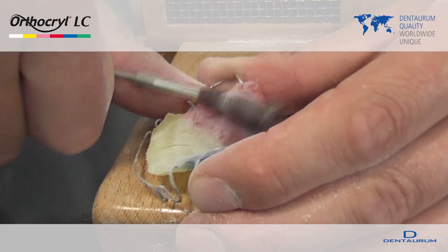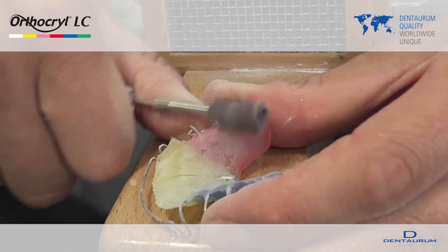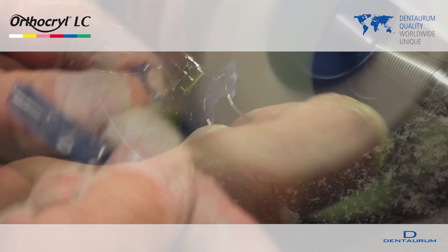Pre polish the appliance with silicone polishers or sandpaper and then with pumice powder and polishing brushes. A high polish finish can be achieved with an Edelweiss acrylic polishing material and a cloth polishing brush.